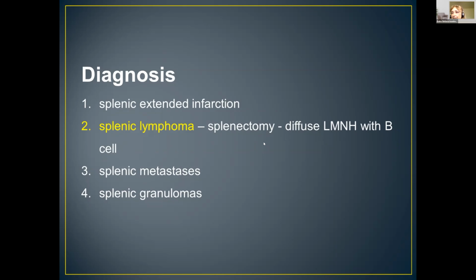But in this case, we consider the pathology of the patient, the history of the patient, because HCV hepatitis is in many cases associated with non-Hodgkin lymphoma, with biological data, with histology.